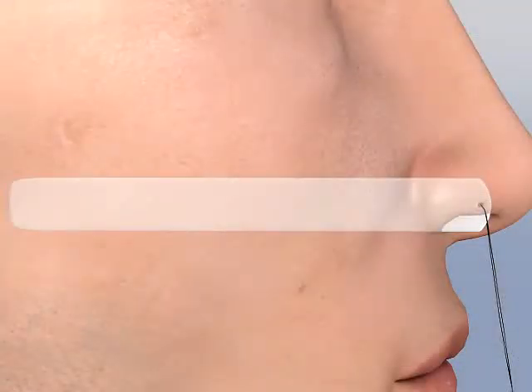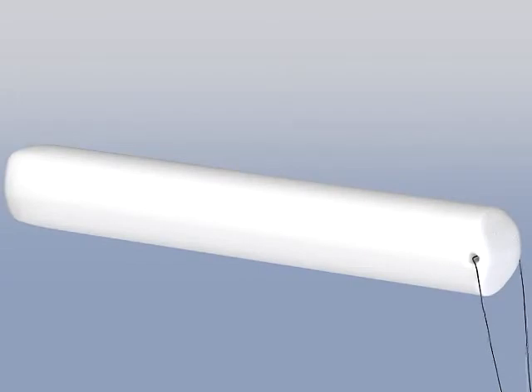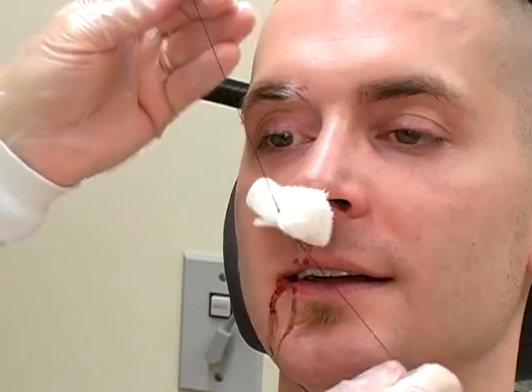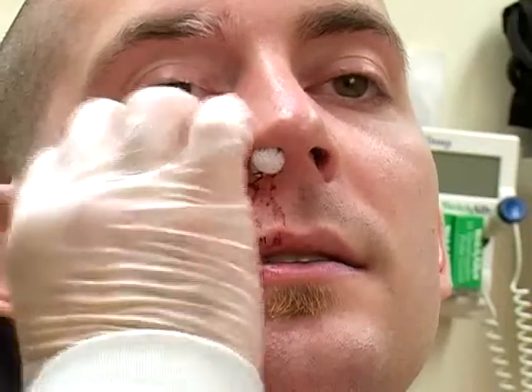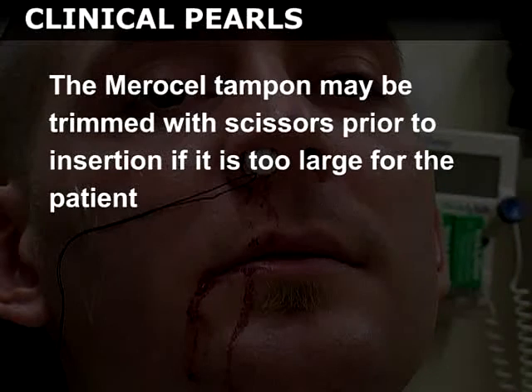Note that this Merocel sponge is inserted deeply into the posterior nasal canal and may be uncomfortable for the patient during insertion. To secure the device, the strings may be tied around a piece of folded gauze placed at the outer nares, or they may be affixed to the cheek using tape or a transparent dressing. The Merocel tampon may be trimmed with scissors prior to insertion if it is too large for the patient.